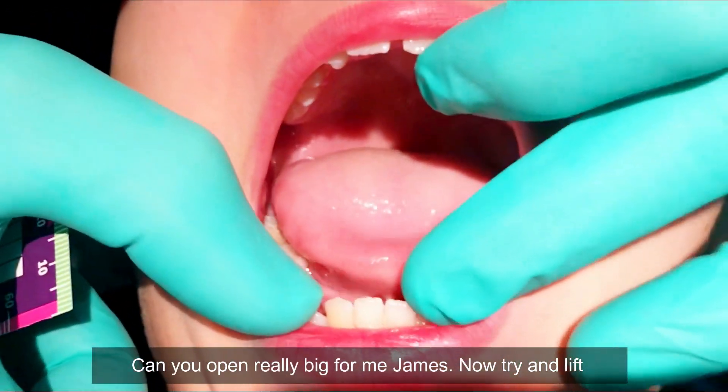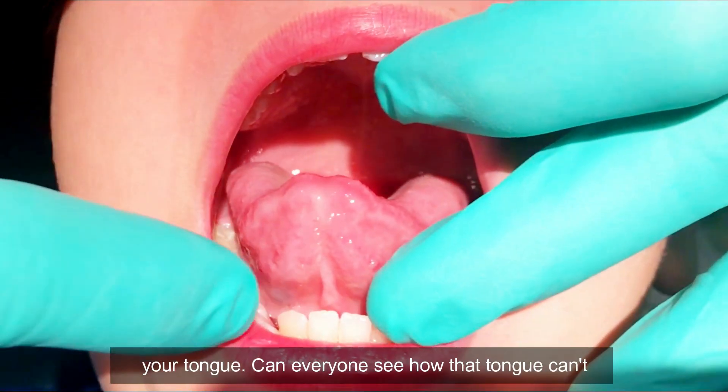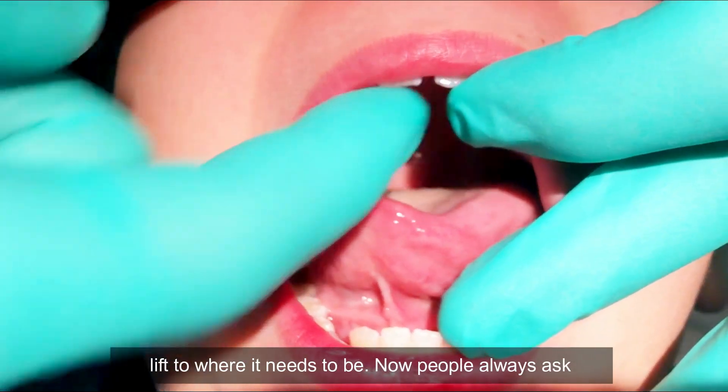Can you open really wide for me, James? Try and lift your tongue. Can everyone see how that tongue can't lift to where it needs to be?